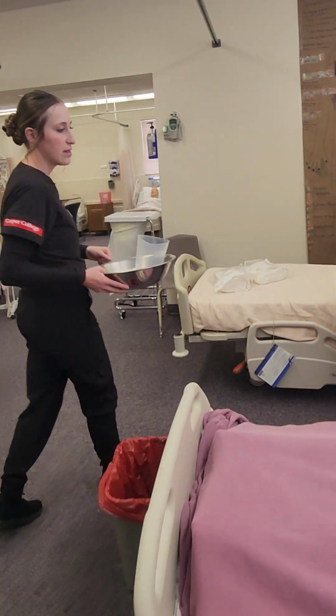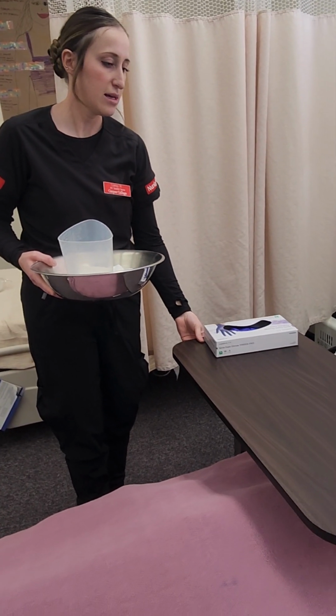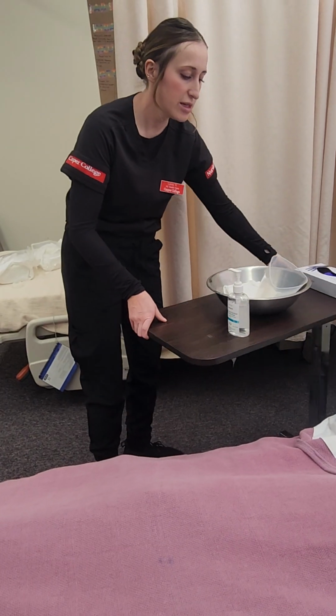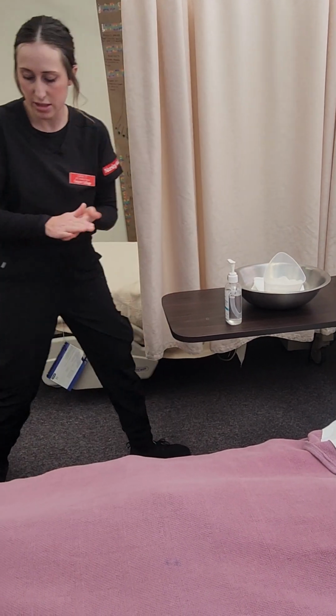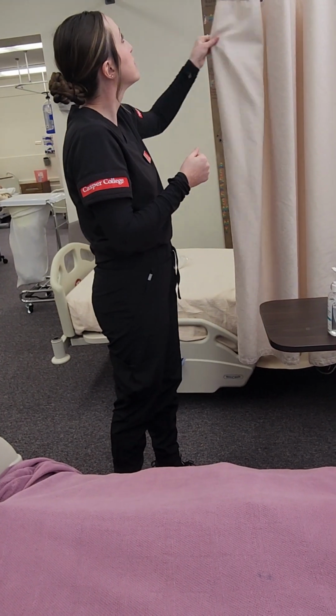Knock, knock. Hello. Hi, my name is Lainey. I'm going to be your student nurse. Hi. Can I move your table? Yeah. Okay. So first I'm on a hand hygiene. Make sure his bed is locked. Provide privacy.